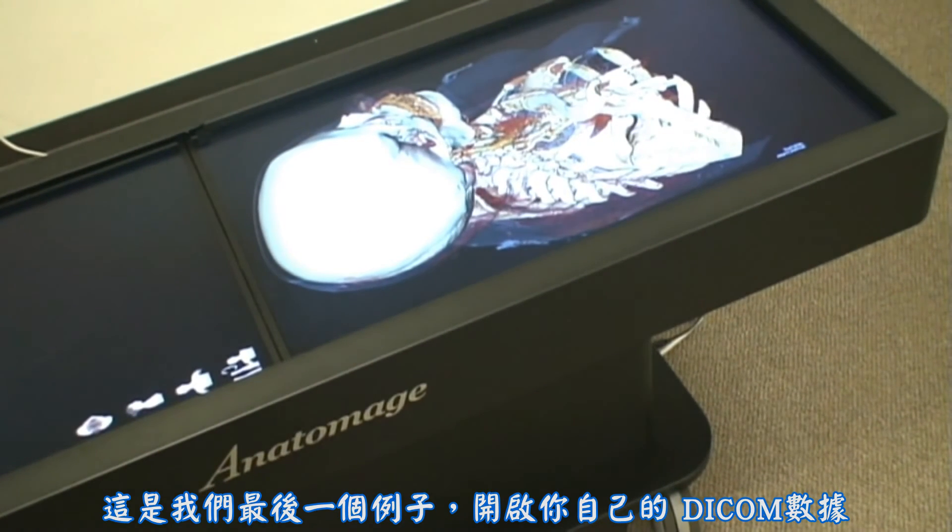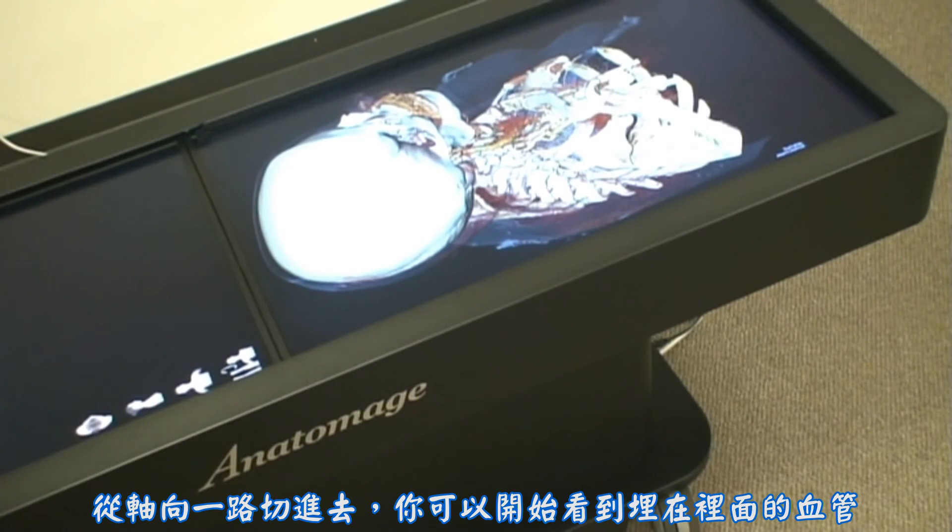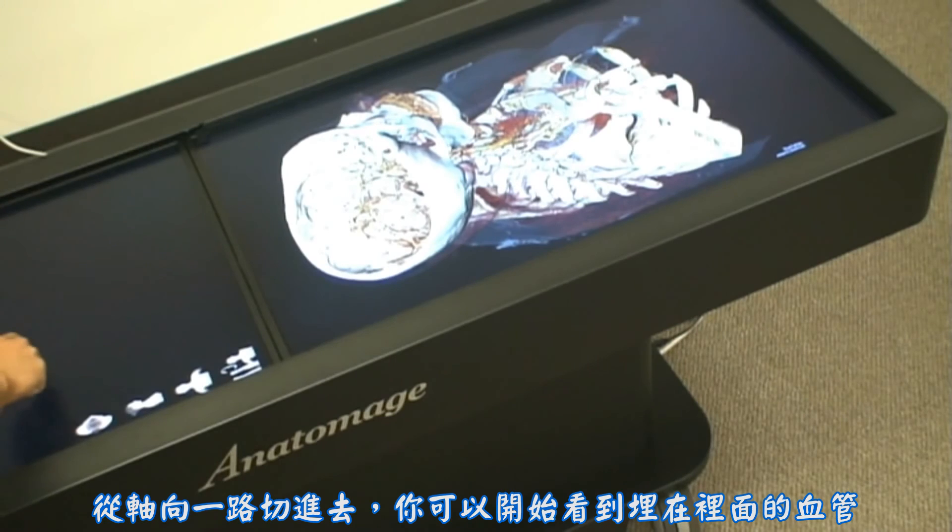This is our last case of opening up your own DICOM dataset. Using contrast media, you're actually able to see the blood vessels in the scan. Using an axial cut, I'm going to cut through and start to see the vessels within the head.